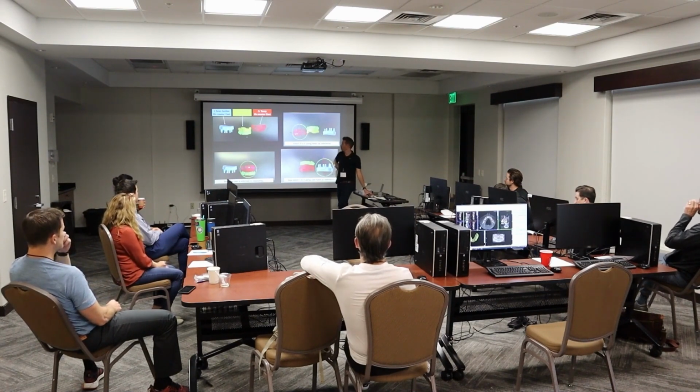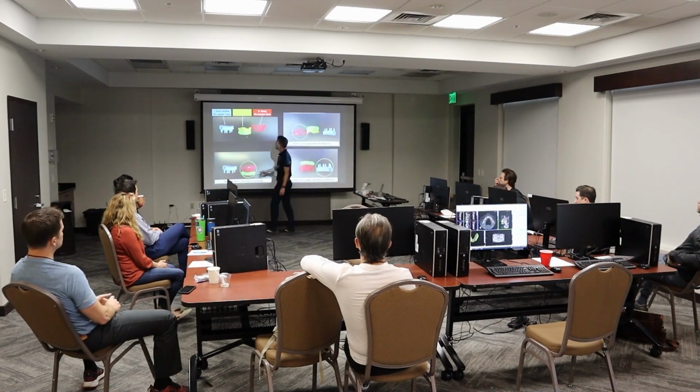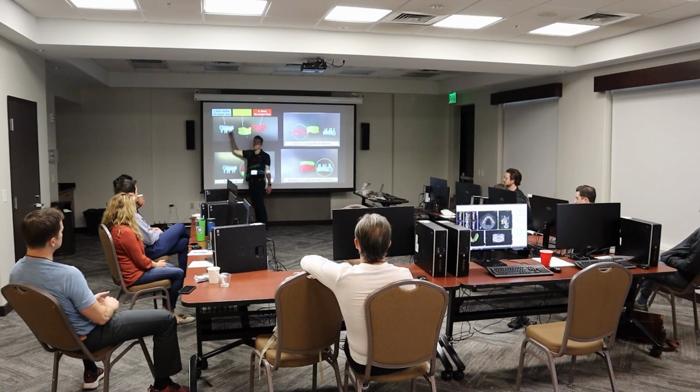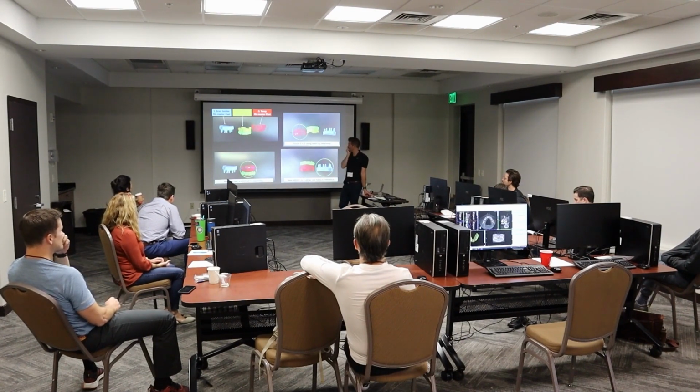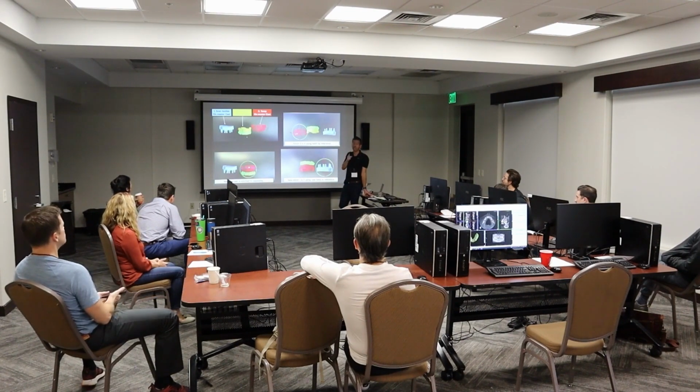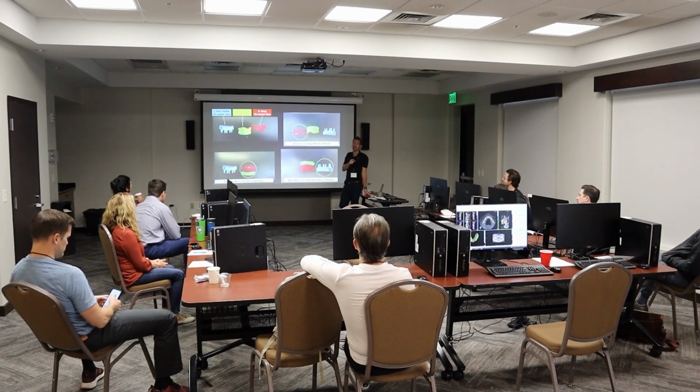What's critical as far as accuracy? The one that's really critical is this one in the box scanner. That's getting your implant positioning. That's the one that you've got to have that accurate, because that's what they're using to relate every implant to each other. But for that one, I haven't done it, but my gut tells me that would be fine.